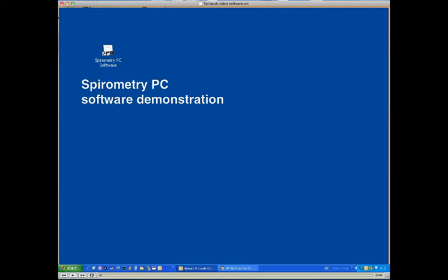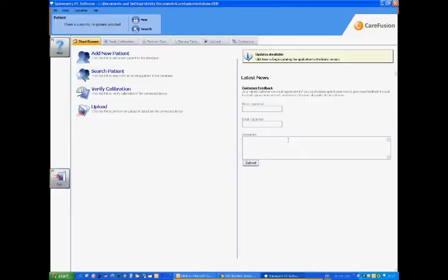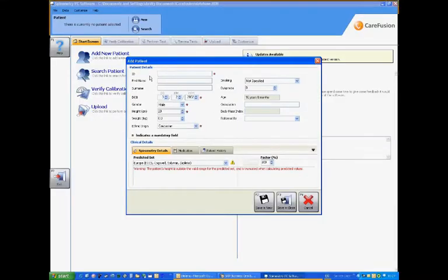Looking at a demonstration of the software: clicking on the item, you would normally go in and add a new patient. In this case, we'll add in Joan Test, and we would add in an identification for that patient as well. We would enter in a date of birth — in this case the 23rd of the 2nd, 1956 — and she's obviously a female patient, so we would select that.